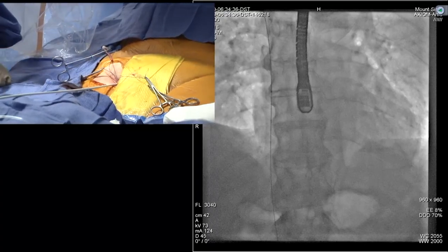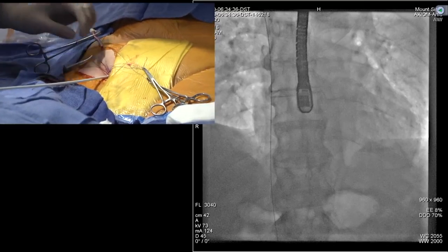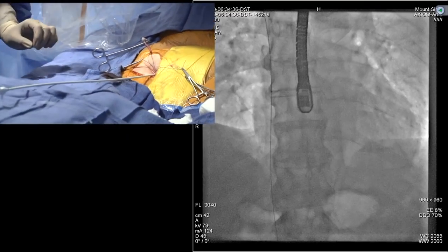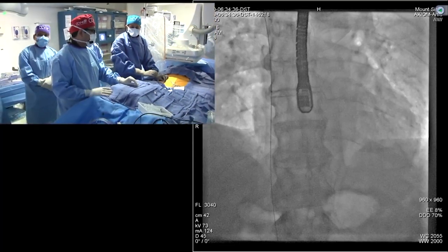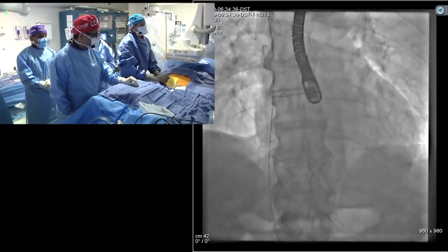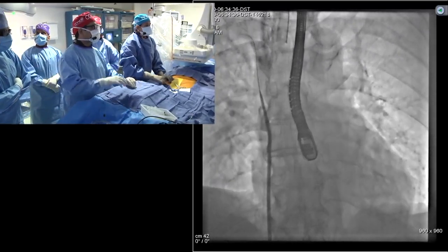This strategy is really fail safe. We have 0 vascular complications in all our MitraClip cases. Yeah, we actually had 1 complication on the MitraClip last year. We did 52, and that was from the arterial side, a 4 French artery. That's when we stopped taking the arterial access. There's no arterial puncture here. With echocardiographic guidance, it's really not necessary to have arterial access in these patients.